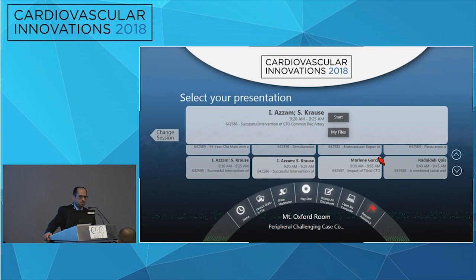We all need to be aware of that when doing procedures on this segment. True, and for any pedal access, I like to keep ACT at least 270 to 300 or 320 all the time. And then we use our band, and unlike radial, we were real light on pressure on our band across the tibial axis.